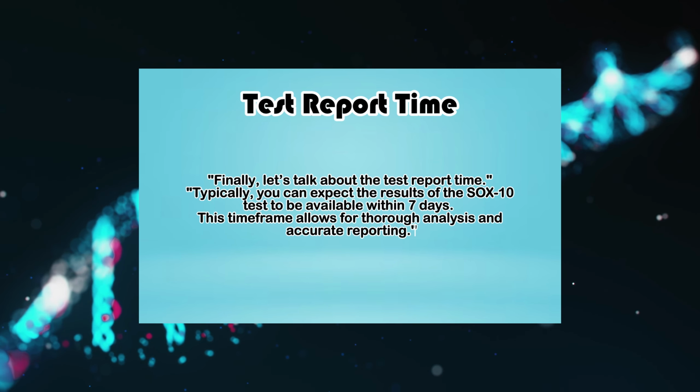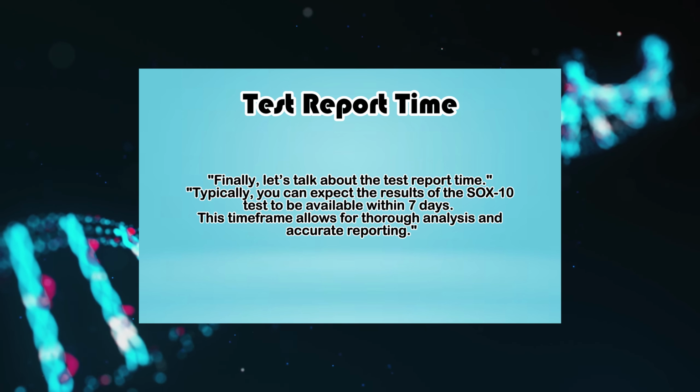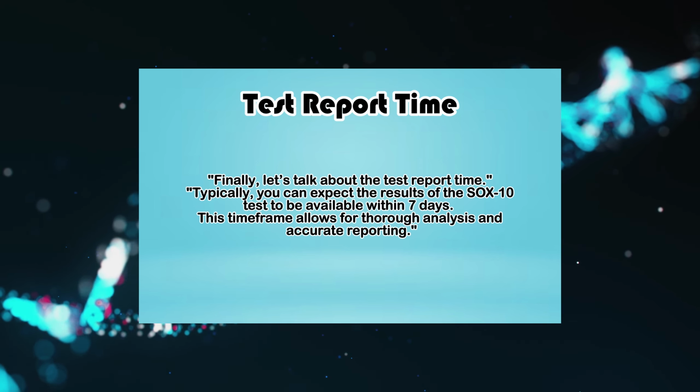Test report time. Finally, let's talk about the test report time. Typically, you can expect the results of the SOX-10 test to be available within 7 days. This time frame allows for thorough analysis and accurate reporting.